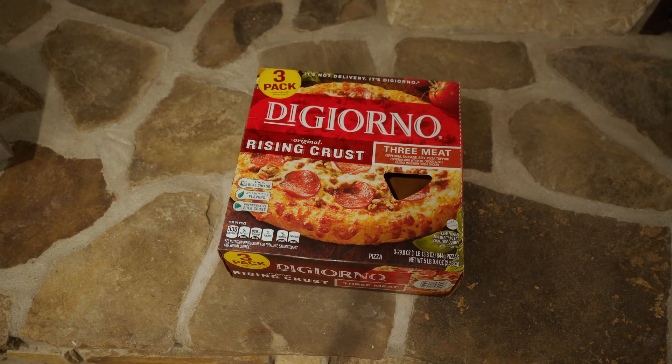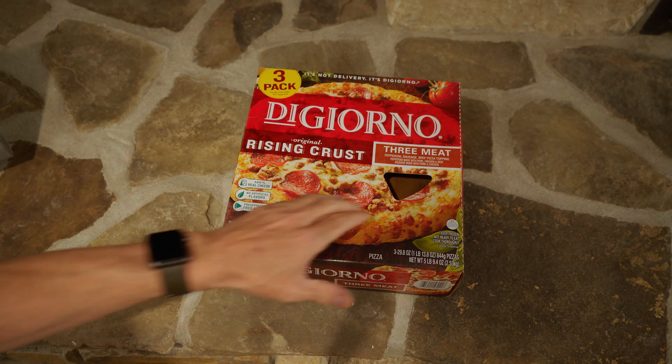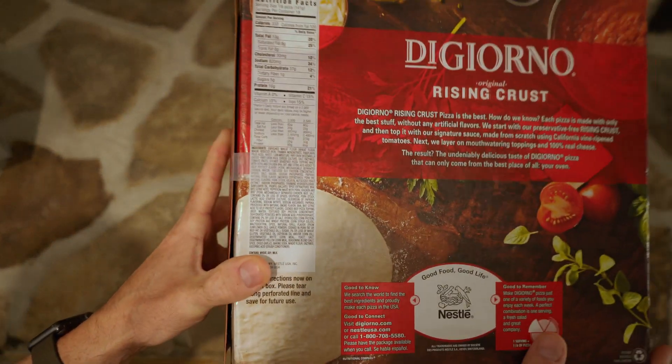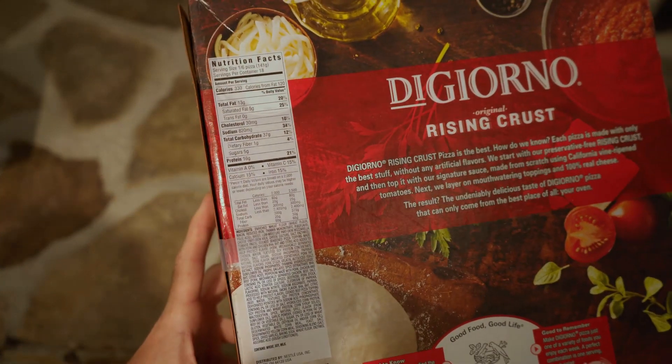I'm going to show a new feature of the open source insulin pump controller called Loop. For the first time, a smart pump can not only factor in carbohydrates but also fat and protein. This is useful for both carb-heavy meals such as pizza, as well as low and no carb meals where it was previously difficult to determine how much insulin to take.